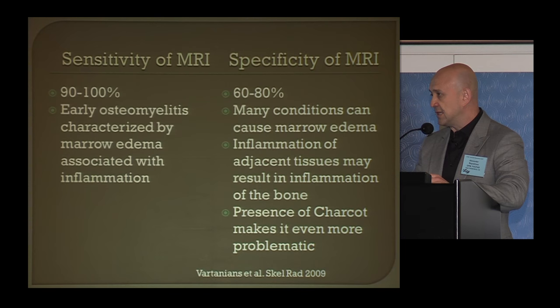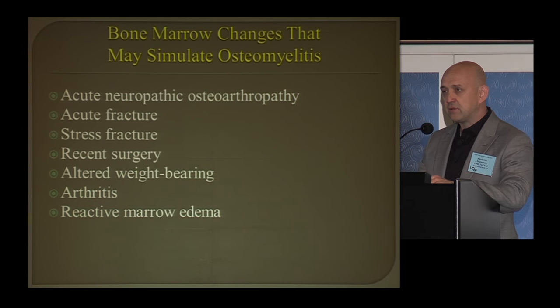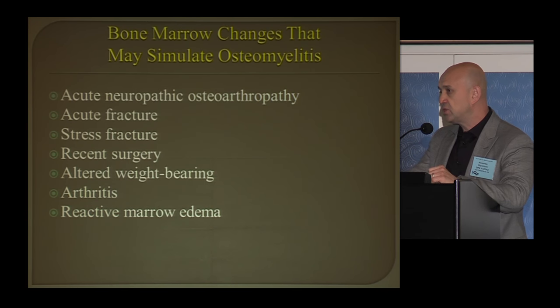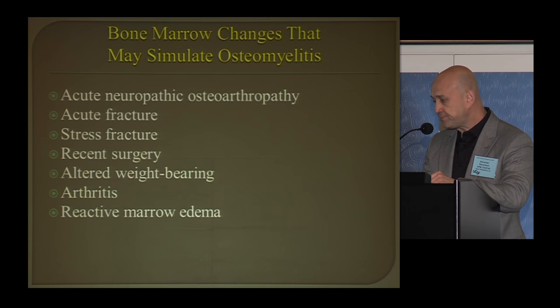The other thing that we see is that the presence of Charcot makes it even more problematic, if not impossible, to diagnose osteomyelitis. So these are some other things that will cause a false positive read: a stress fracture, an acute fracture, a recent surgery on the foot in that vicinity, arthritis, or altered weight bearing.